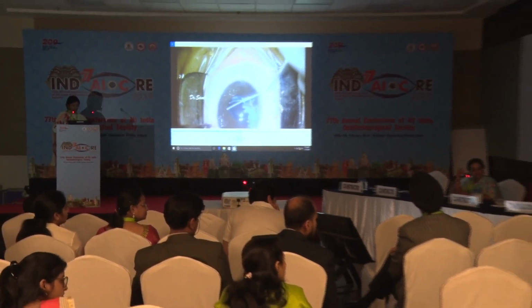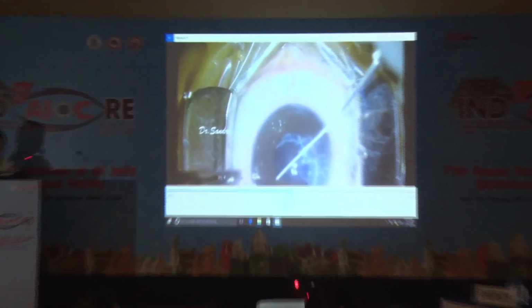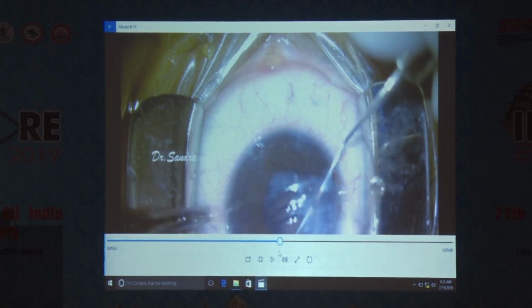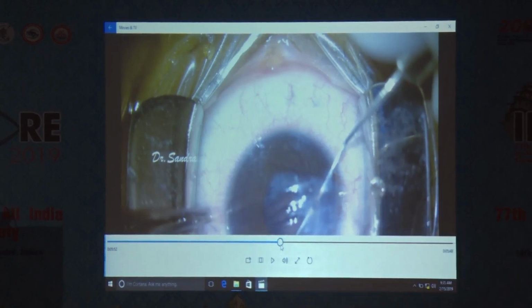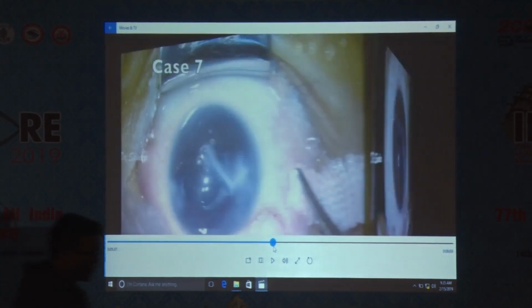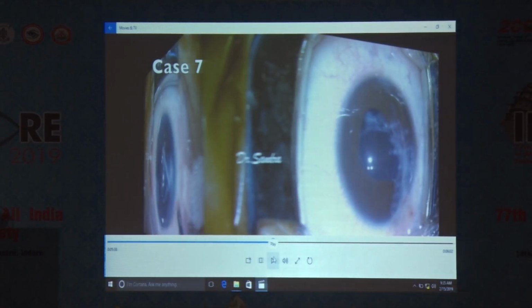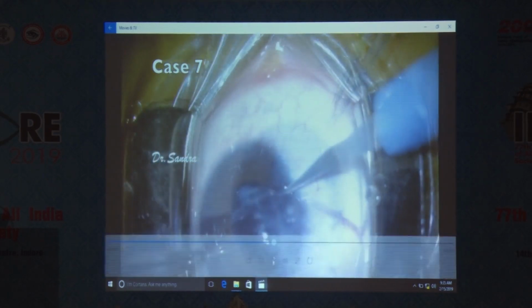You took the haptic. What type of lens was it? Okay. What type of lens did you put, sir? Okay, ma'am. And what was the corneal diameter? Okay. And how long do you have follow-up, sir? I did posterior capsular rhexis plus vitrectomy, and both eyes were good. It was associated with alternating convergent squint. After 1 year, I had corrected the squint also. Oh, okay, so you've done squint surgery as well. Yeah, we can go, yeah.